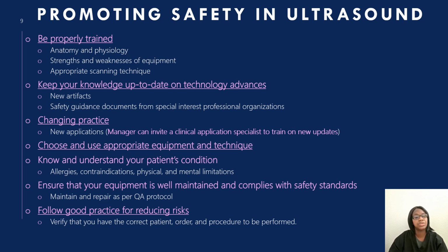You want to make sure that you have someone properly trained that can know the anatomy, that can know the machine, where the buttons are located, and how to annotate the picture. You want to stay knowledgeable and informed on the latest technology changes. If you can see artifacts better on this machine versus that machine, if the pictures are coming out better, or maybe they're coming out worse, and you need to talk to your supervisor or manager about getting a new machine.